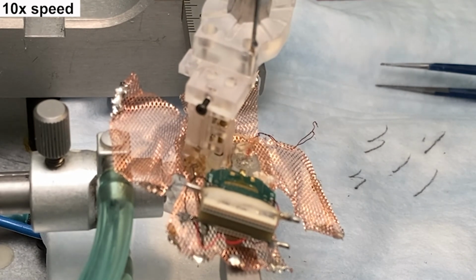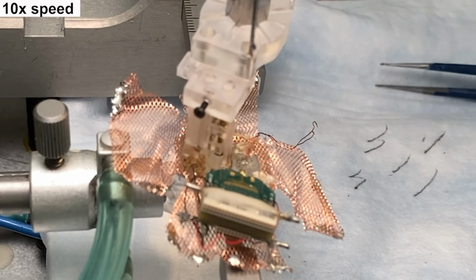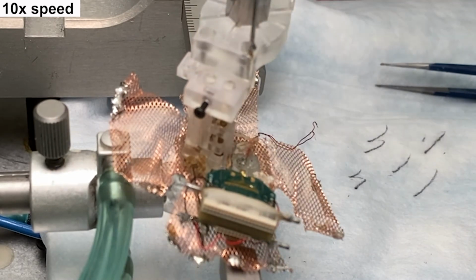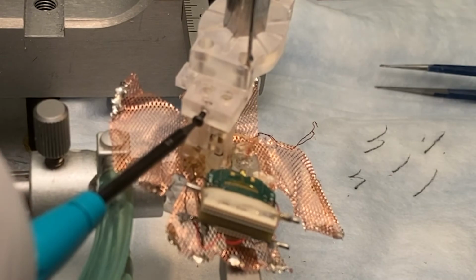So here you can see the alignment can take some time to find that perfect alignment. You can see I bump into this drive. Then you just stop, start moving things around, and make sure you get it right. And once you find that, you just go down. Then you secure the drive with the side screw.